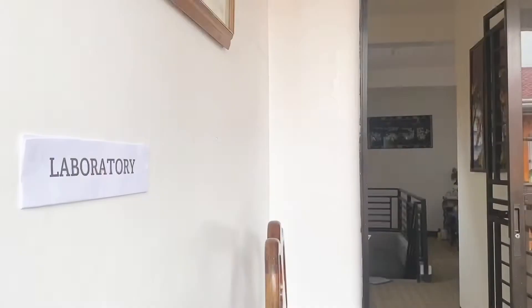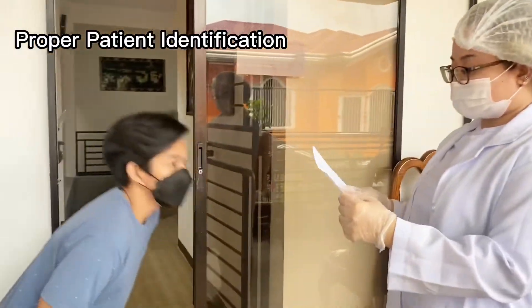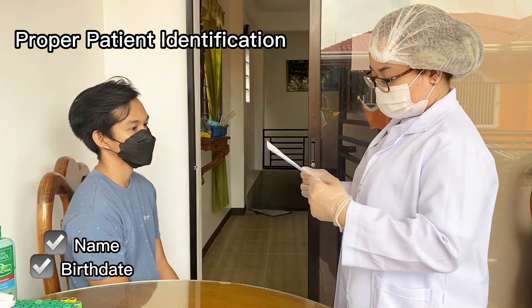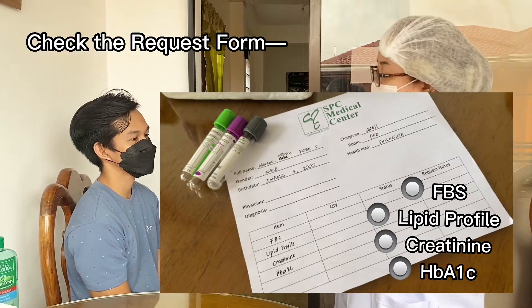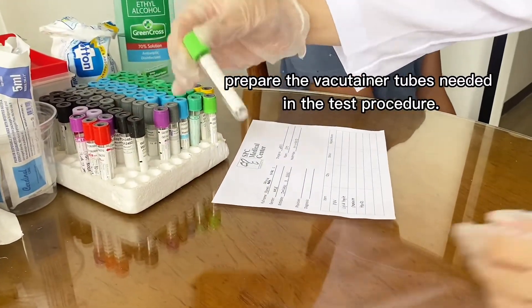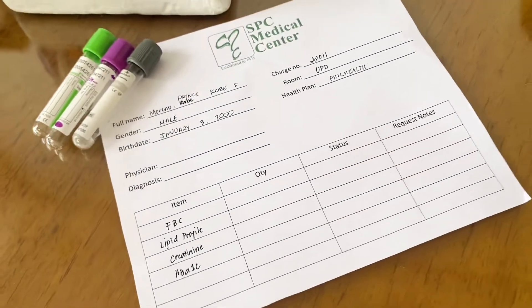For the next step, we need to identify and prepare the patient. For this procedure, we're going to use three vacutainer tubes. First one will be the heparin tube, which we'll use for the lipid profile and creatinine. Next is the EDTA tube for the HbA1c. And lastly, the sodium fluoride tube for the fasting blood sugar.